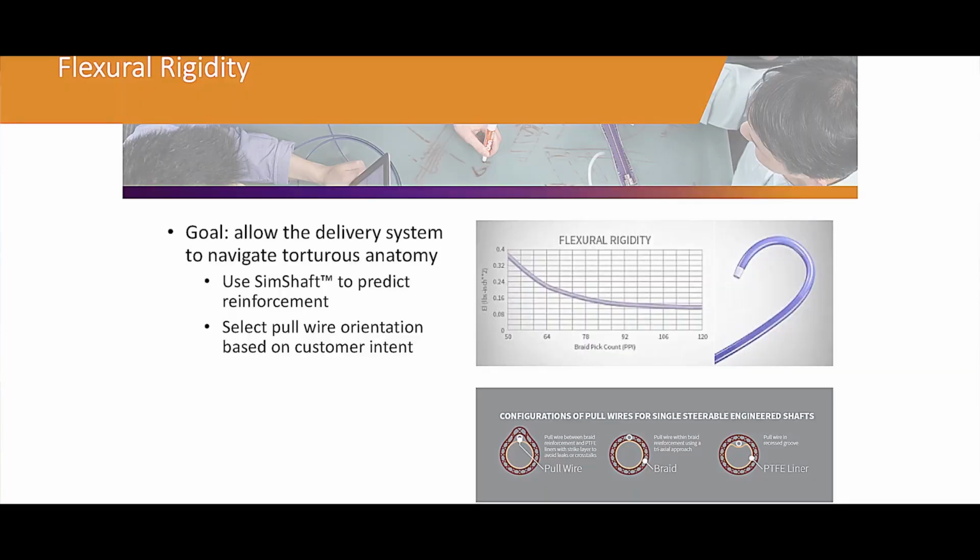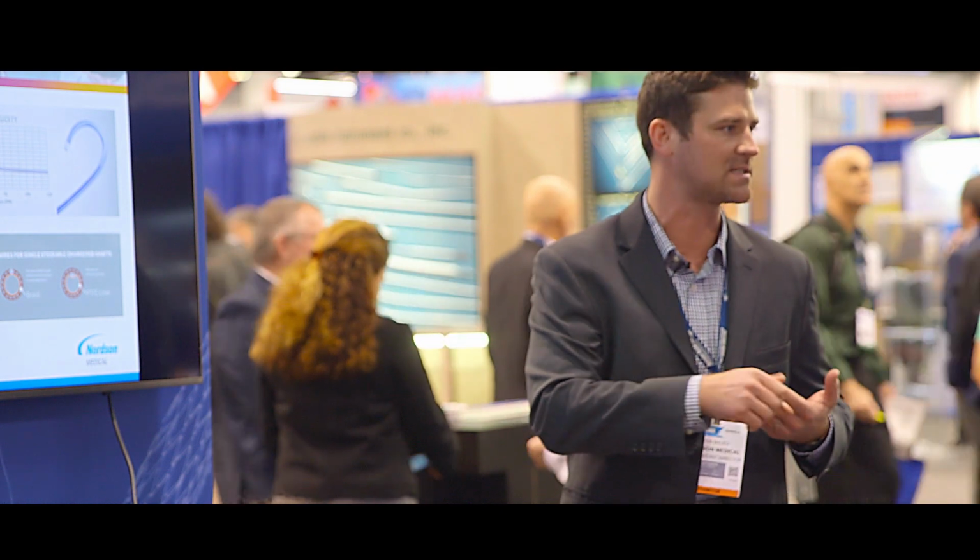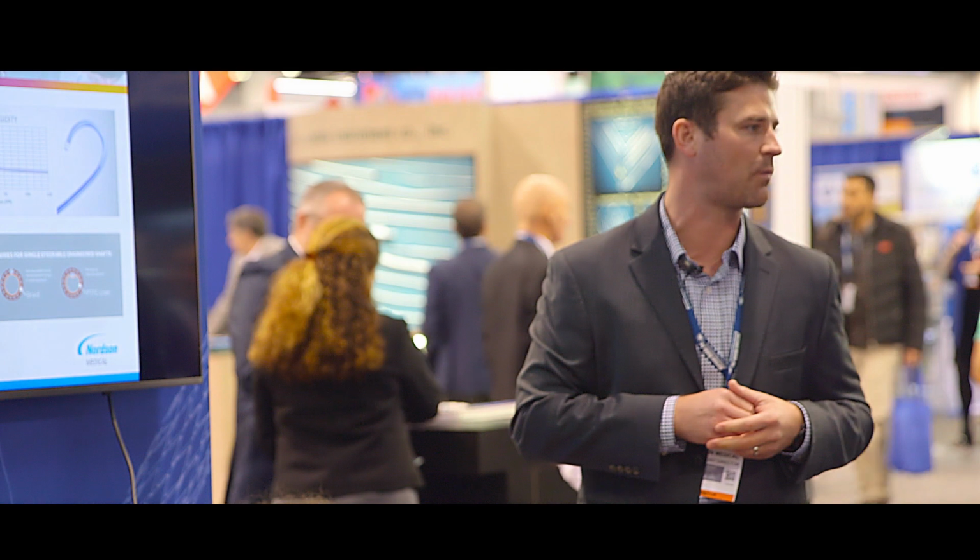And then for the flexural rigidity, as I said, this is counterintuitive for how it plays off the torque response. As you get stiffer and stiffer materials, you start to lose on the flex side. So we have a software tool that we use called SimShaft. It allows us to get some quantitative data on how we anticipate these different key performance features playing out when lined up side by side with one another. It allows us to create a baseline and then look quantitatively at how we think a change to that design is going to impact the performance of the catheter. So we get a good understanding, before we kick off development work, of how we think the results are going to play out when we stack up the torque response, the tensile strength, the kink resistance, and the flexibility of the system. It gives us really good data and a starting point for how we want to start developing those systems.